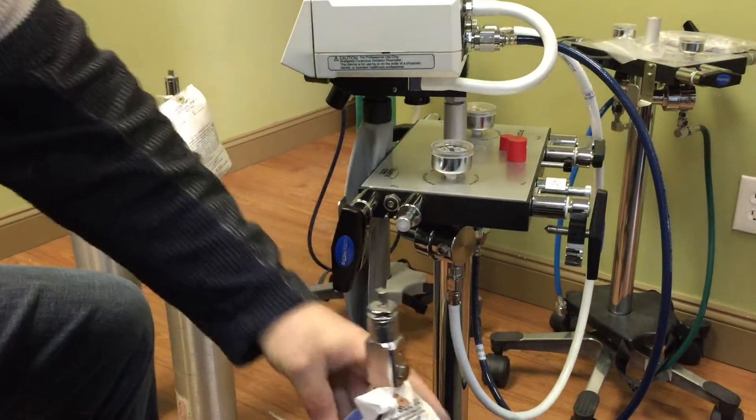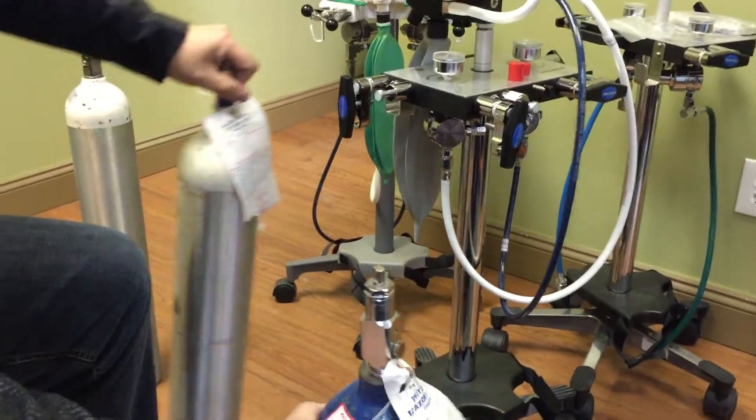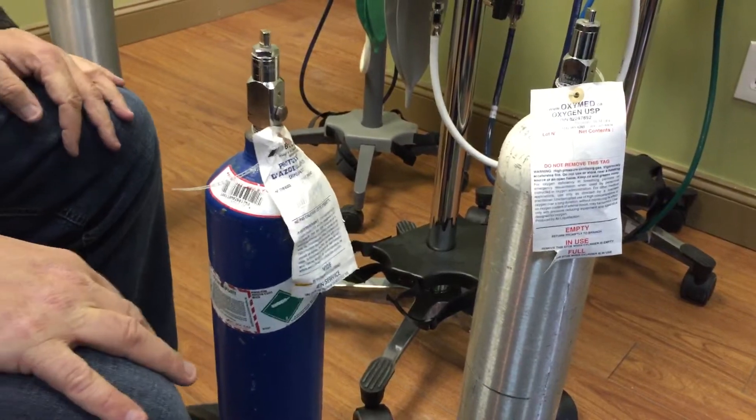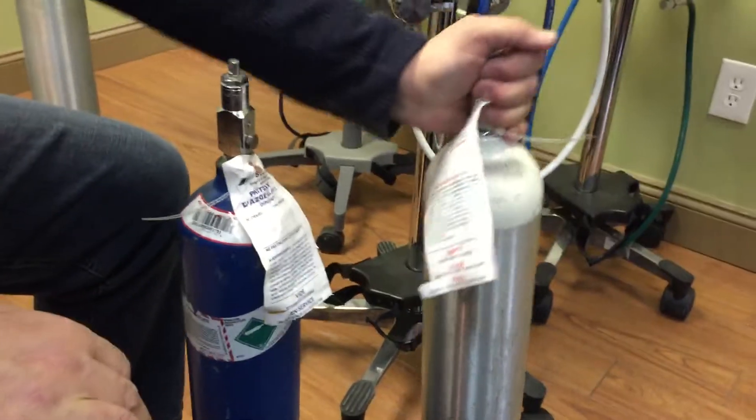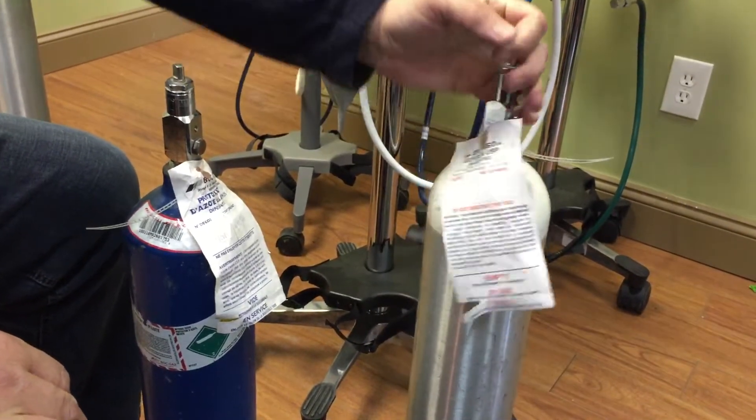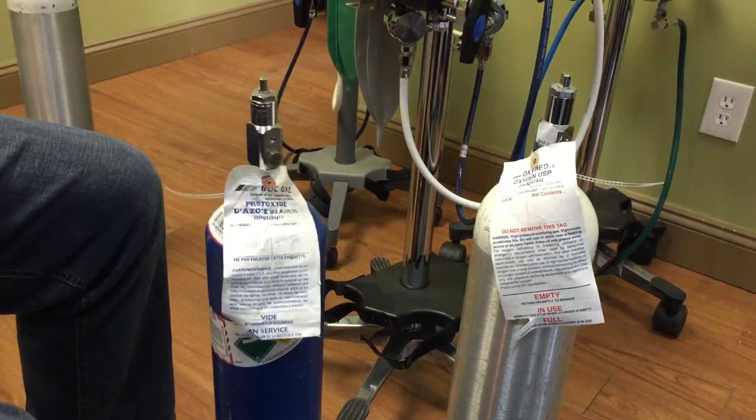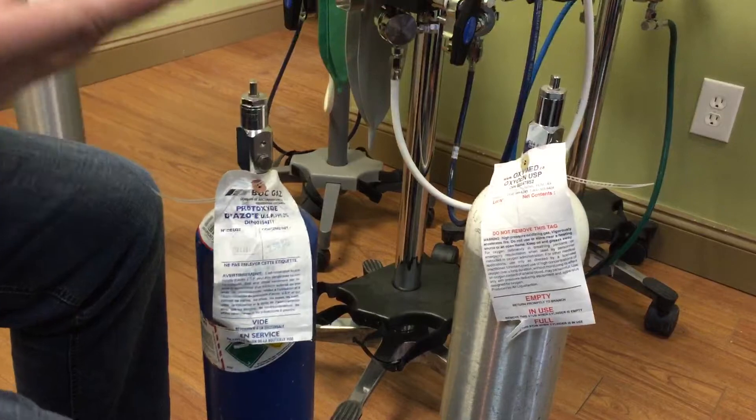A little bit on nitrous and oxygen. The oxygen tank is actually very light. The nitrous tank is very heavy. The reason being is nitrous is a liquid. Oxygen is like a gas form.